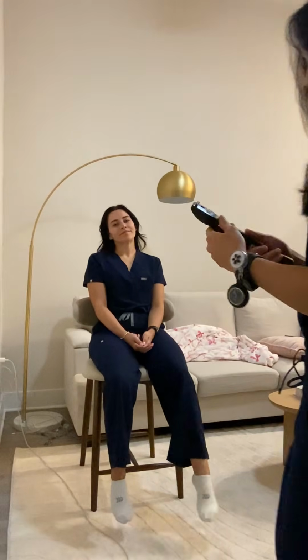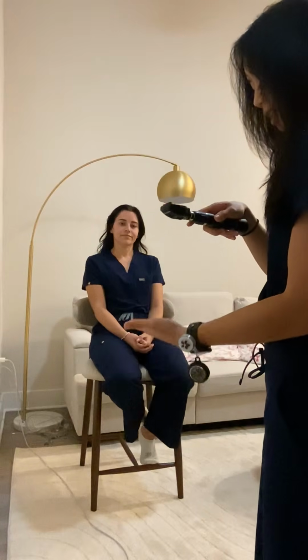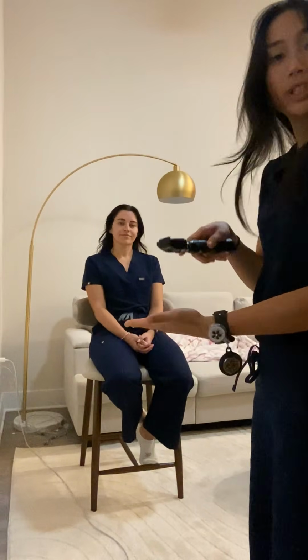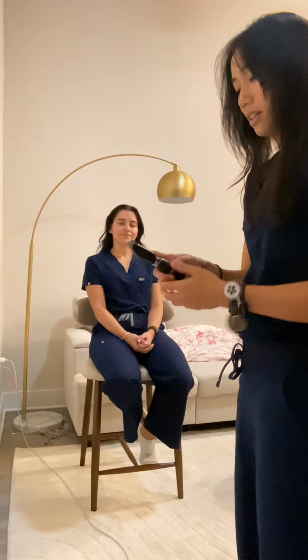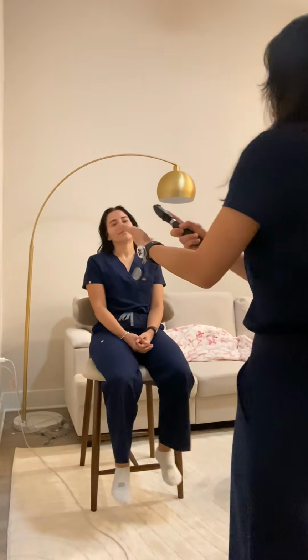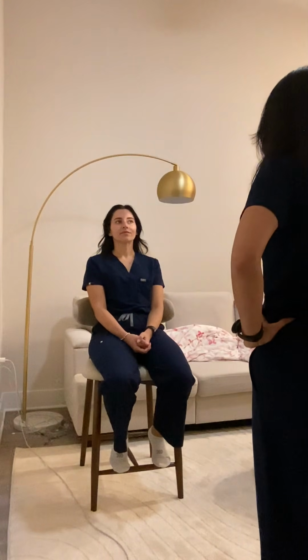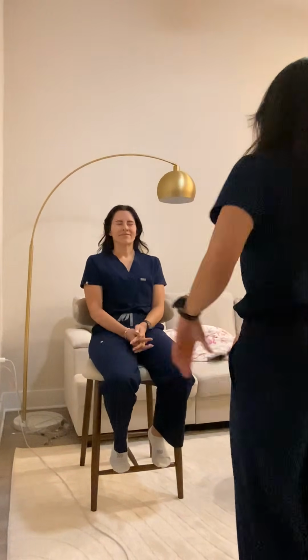Now I'm going to be performing the fundoscopic examination, ensuring that my light is on and that my finger is on the diopter and the wheel is starting at 0. All right, and I'm going to be performing this test bilaterally. I am checking for the symmetry of the corneal reflex. Perfect. The corneal light reflex is all intact and symmetrical.